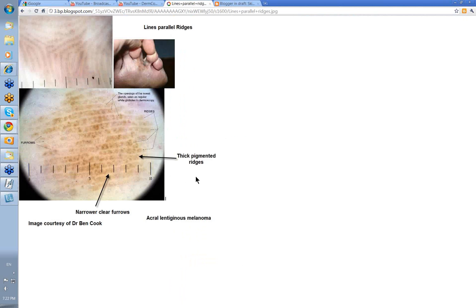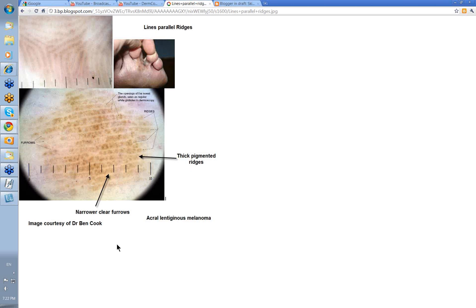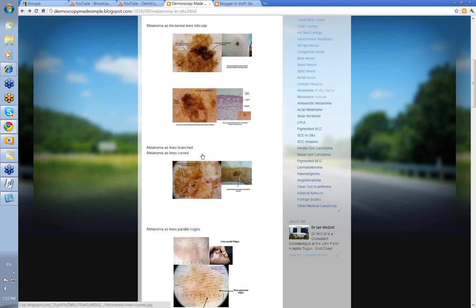Lines parallel ridges in the feet — a lovely sign of melanoma. Clinically, this area of pigmentation has the melanin confined to the ridges, not the furrows. There are the ridges here, these are the furrows — so thick pigmented ridges. And this is an acral lentiginous melanoma.